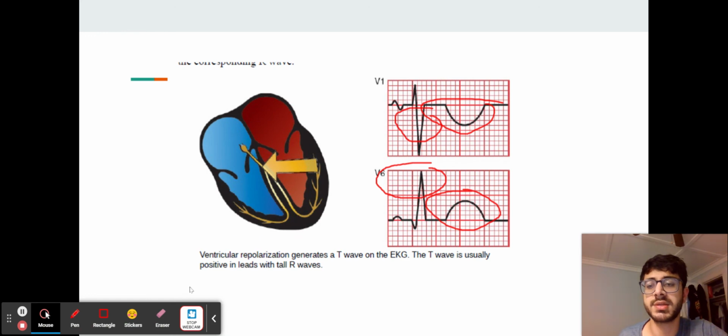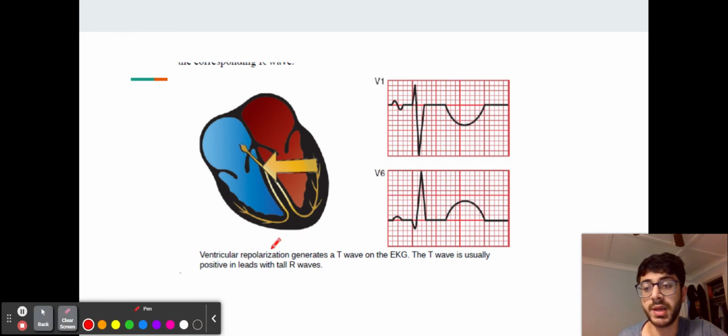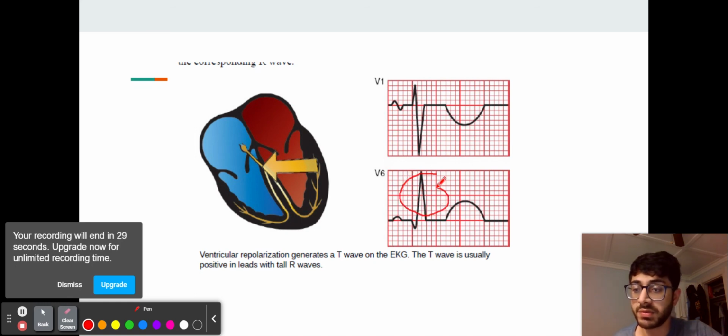Again, there are reasons for this. I just did a really bad job of explaining it. But how the electrode responds to repolarization is the opposite of how the electrode responds to depolarization. And that is a really weird thing to get your mind around. I don't have my mind around it. But remember, I'm running out of time, so this video ends here.